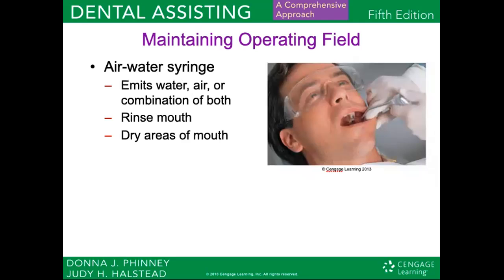The air water syringe emits water, air, or a combination of both. Its job in maintaining the operating field is to rinse the mouth and also to dry areas of the mouth that might otherwise be saturated with saliva or blood.